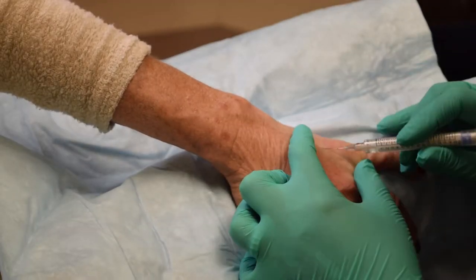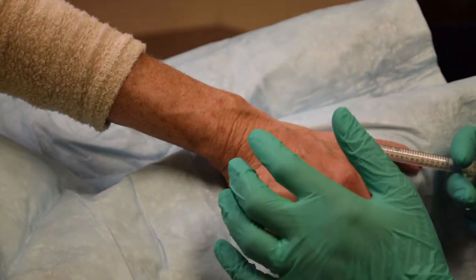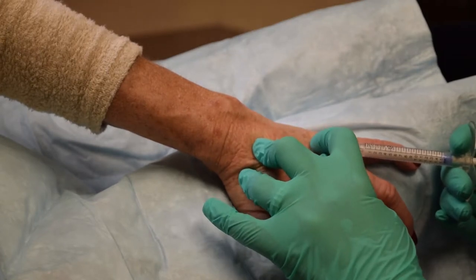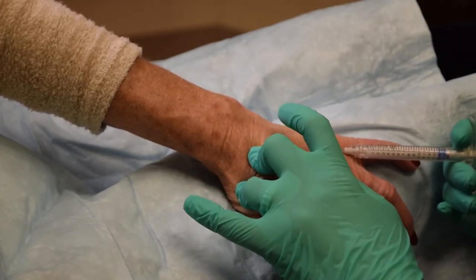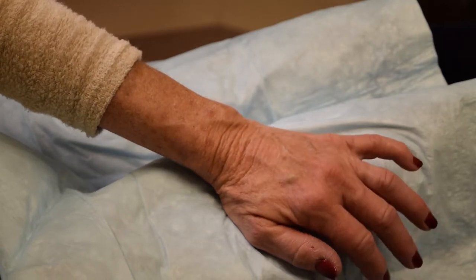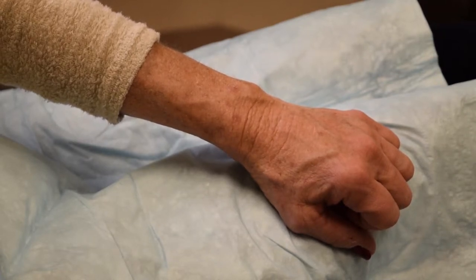I'm first correcting the fourth interdigital web space. I can feel the product going in, and delivery is much easier through the cannula than through the needle — there is much less resistance. I use my finger to feel how much product was delivered and whether it is sufficient for that particular area. The next portal entry is created with a 25-gauge needle. I usually prefer the patient to ball the hand into a fist to see exactly where I need to be. After the quick prick with the needle, I insert the cannula and this part is already painless.